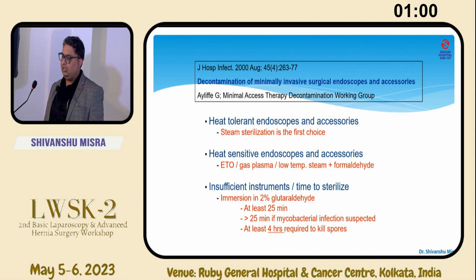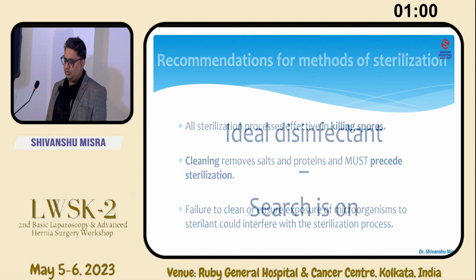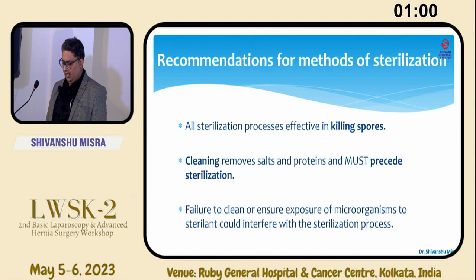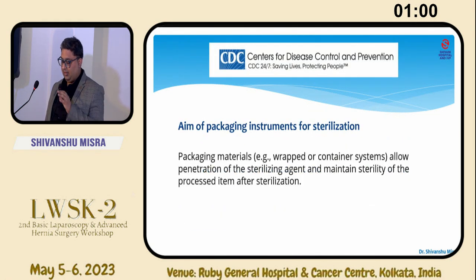Always make sure the clean cases, like the hernias, are done first, and the clean-contaminated or contaminated cases are done in the second or third rounds, respectively. So there's always an ideal disinfectant which the search is going on. And the most important thing after sterilization is the packaging, which I'm not here to talk about because I've been given only 8 minutes to talk.